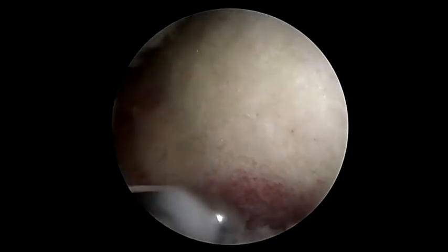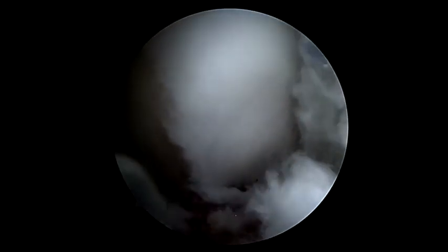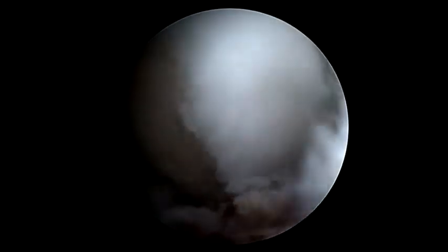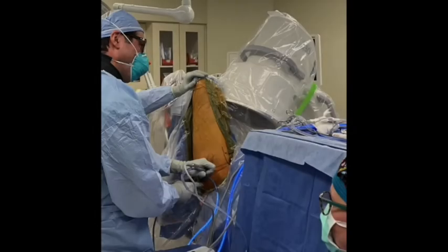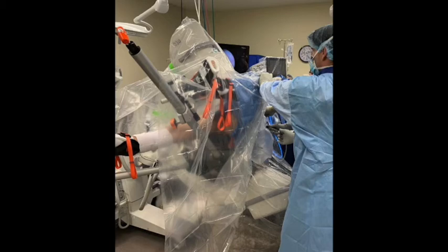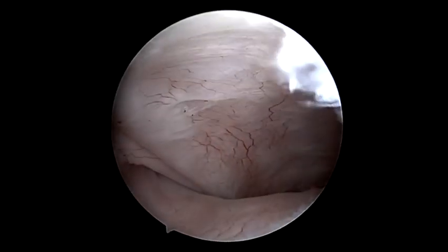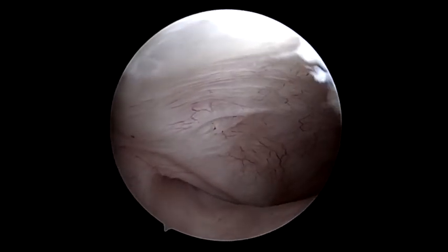Our attention was then turned to the peripheral compartment to address the large circumferential cam lesion with an arthroscopic burr. The hip was progressively moved from flexion and neutral rotation to internal and external rotation positions. Most notably, to achieve adequate decompression of the inferior medial and posterior medial regions, the hip was flexed and externally rotated to allow for the burr to move in this direction.